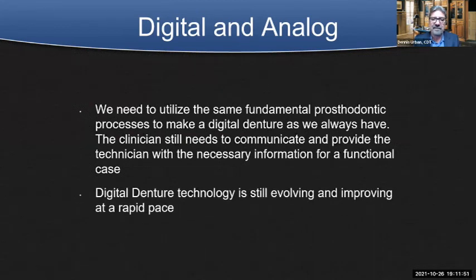And digital technology is still evolving, like I mentioned before, and it's improving at a rapid pace. If you asked me probably 2.5 years ago about printed technology, I would just shake my head no. I didn't want anything to do with it. The material was brittle. It wasn't aesthetic. The bond wasn't great with the denture teeth, and it didn't look great. It wasn't that functional either. But we've come such a long way in 2 years. I want to show you some of the technology in a little while.